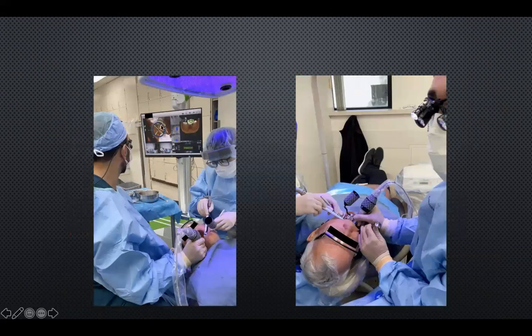I'm drilling and I'm looking at the screen. I cannot look at the patient's mouth, or I can look at the patient's mouth, but ideally I should be looking at the screen and making sure that the position of my drill is the same as my virtual implant plan. Otherwise, I'm going to be going somewhere else. Even if I went somewhere else, or there was a change in the angulation or the depth, I will still see the tip of my implant, where it is relative to the bone or relative to adjacent teeth. And this is the nice thing about this technology.